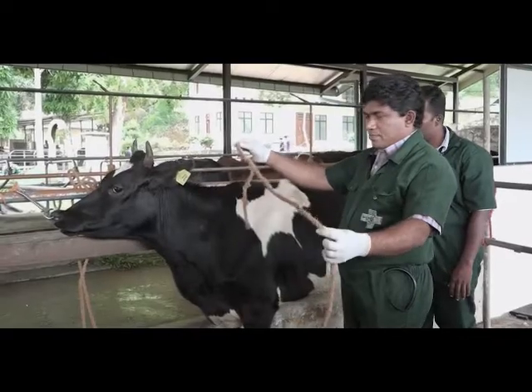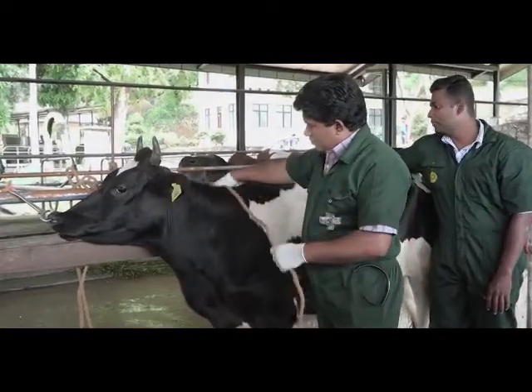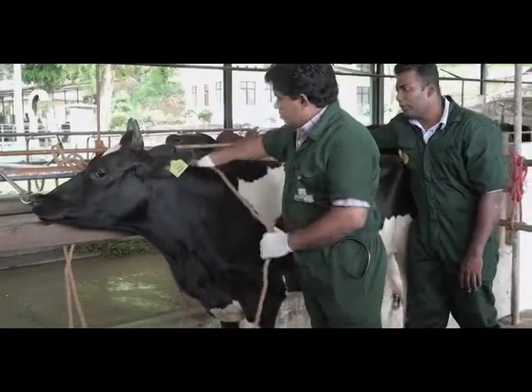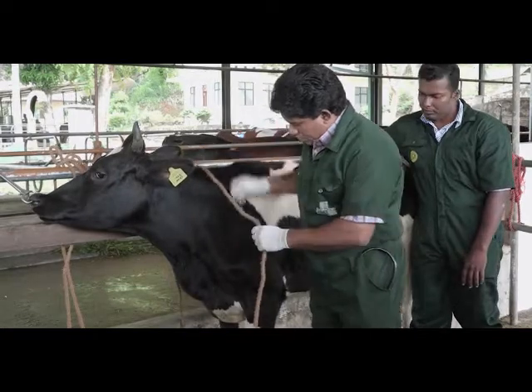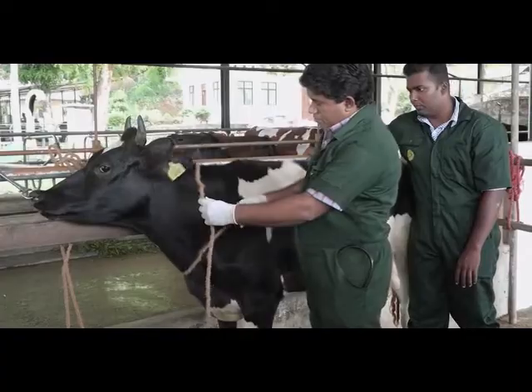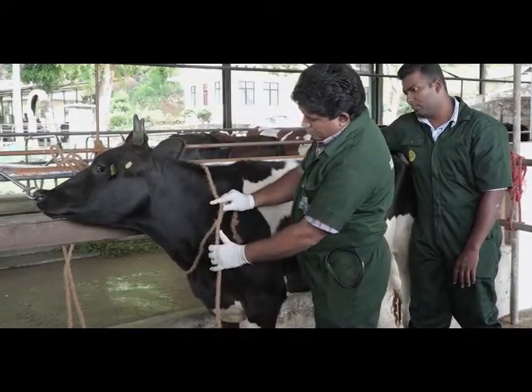You might not find a jugular clamp under the field conditions. Therefore, we are showing you another easy technique. In the field, you can use a rope or the neck belt of the animal to arrest the jugular vein. First, put the rope around the neck of the animal and apply a bowline knot as demonstrated.